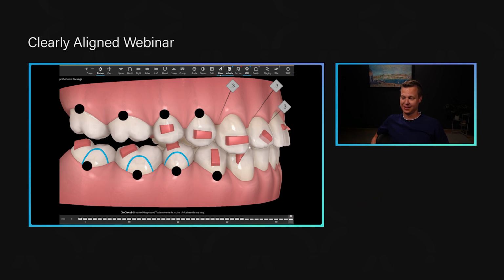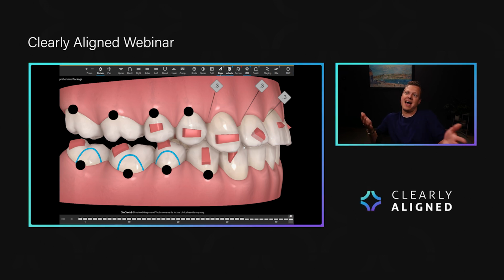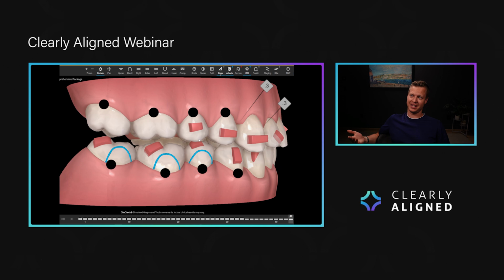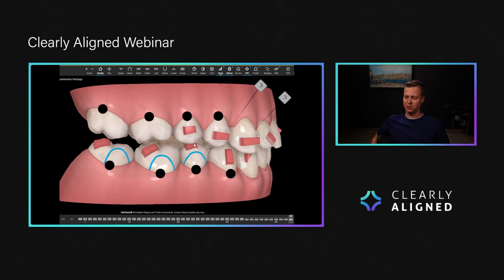but it doesn't necessarily mean that's what's going to happen to the teeth. If everything happened the way you planned it on your ClinChecks, you wouldn't need me right now. You wouldn't need TADs either. You would just accept your plan and you'd call it a day and it would work and it'd be perfect. But that's not how it works. And so do not, in my opinion, be scared of black or blue dots. It means that, yes, we're pushing against those teeth more, but it doesn't mean that it's not going to work or that it's inconsistent even at working.